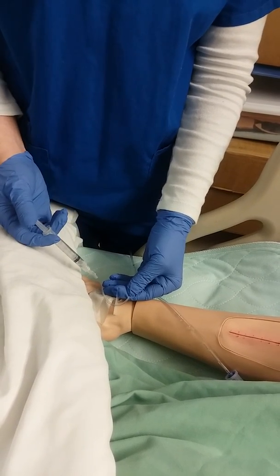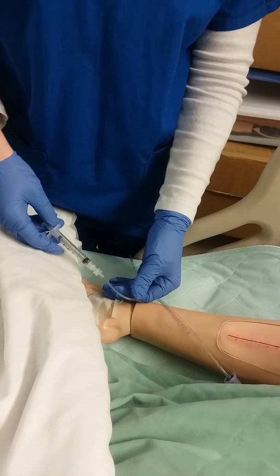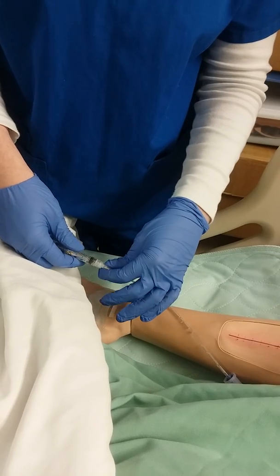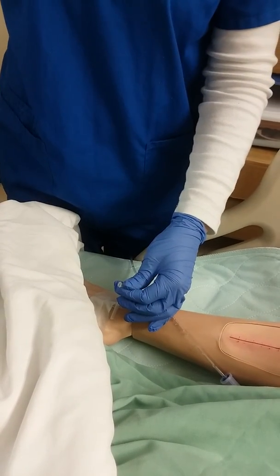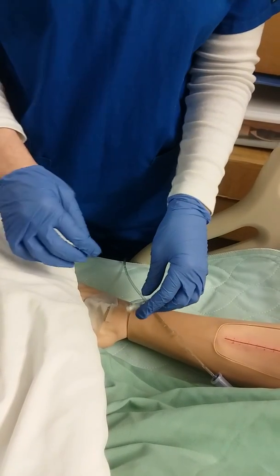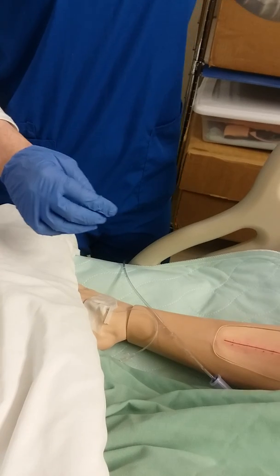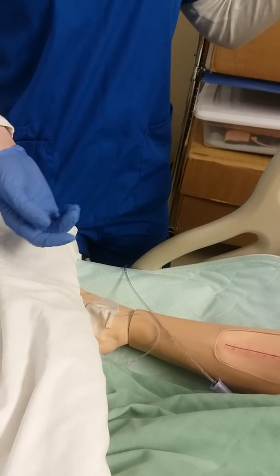For the purpose of this video, we'll say that the minute has gone by. I then would remove my syringe, and I would put the safety on if needed, and I would allow the IV infusion rate to continue to flow, and making sure to check it if I need to reset it.